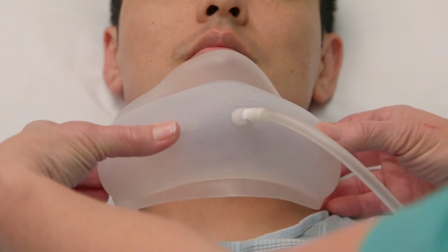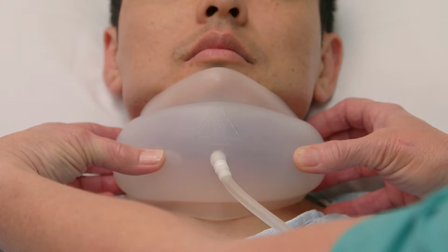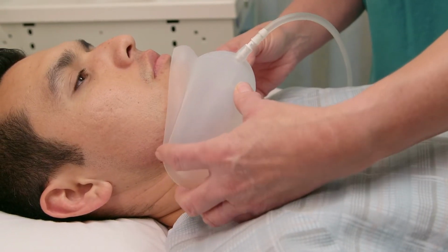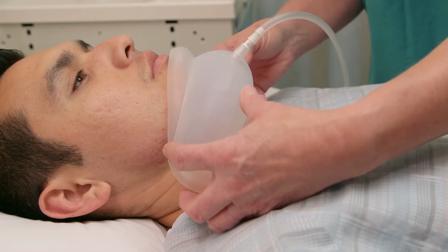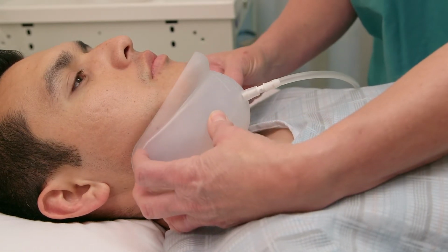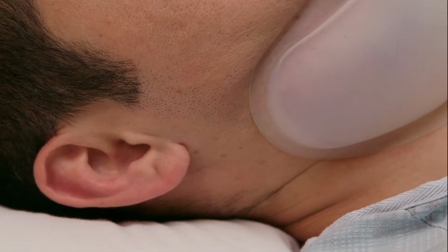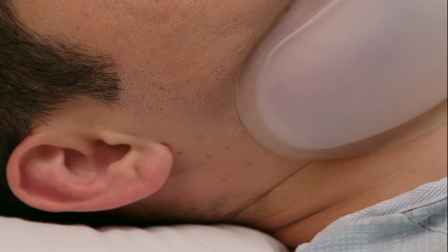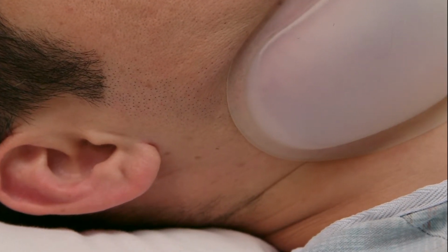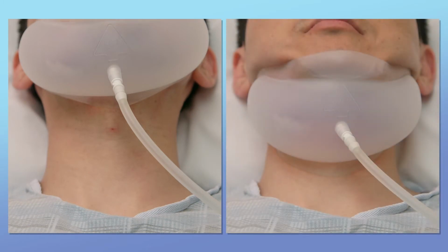With the protective liner removed, orient the collar with the arrow pointed up toward the patient's nose. The first point of contact should be positioning the patient's chin in the chin cup. Holding the ends of the collar, rotate the collar until the lower flange contacts the patient's neck, at or below the thyroid notch. Then allow the ends of the collar to contact the patient's neck just below the ears to create an airtight seal. If the lower flange contacts the patient's neck above the thyroid notch, the collar should be repositioned slightly lower on the patient's chin.